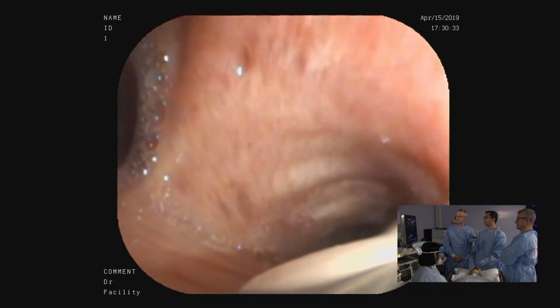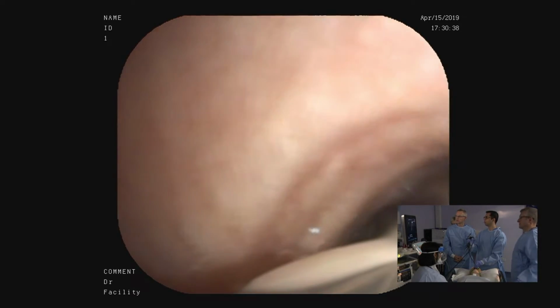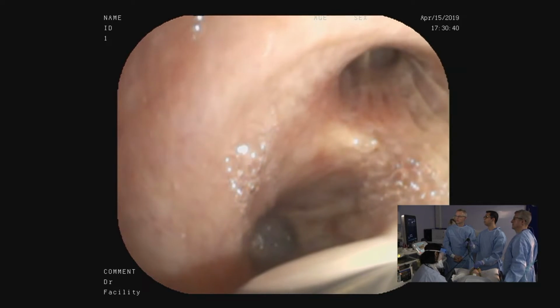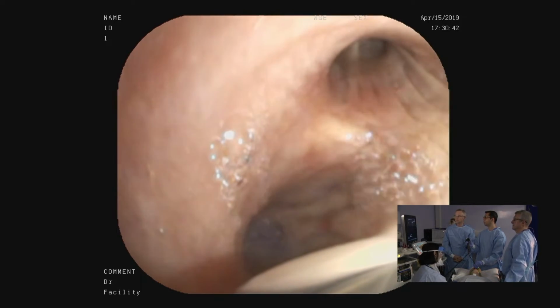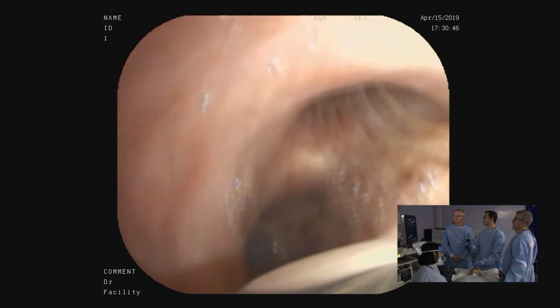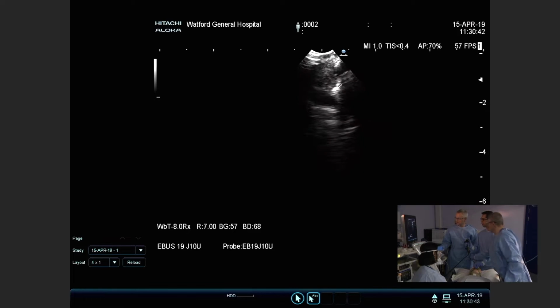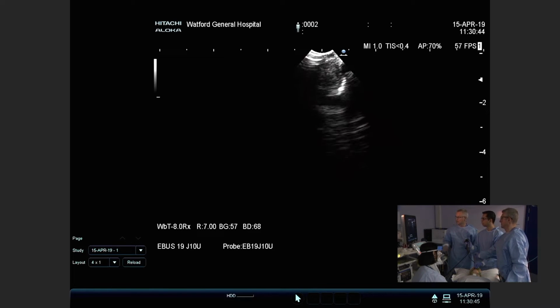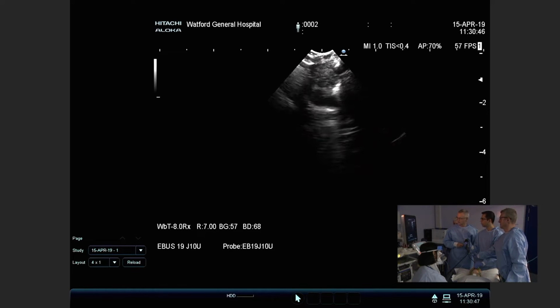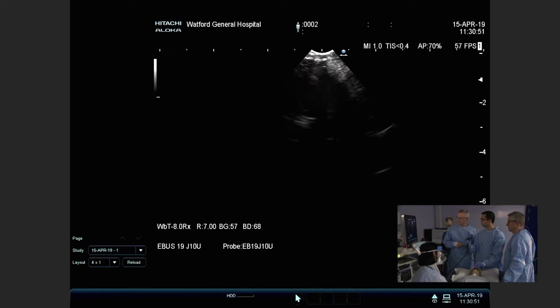So for 10R, you just go proximal to the origin of the right upper lobe bronchus that you can see at 12 o'clock position. So you come up and just proximal to the origin of it should be 10R. And here it does look as if we're picking up something. Yes. And I will gently come up because I think that's an azygous vein coming into the SVC.